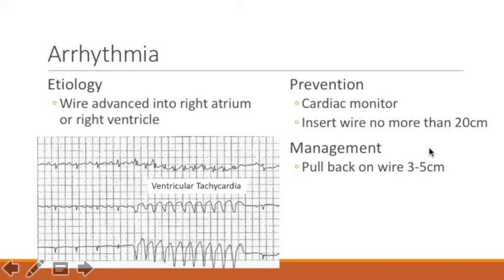You really shouldn't have to insert your wire more than 20 centimeters to try to keep it out of the heart. You only have a 20 centimeter long catheter, so there's no need to insert the wire more than that.